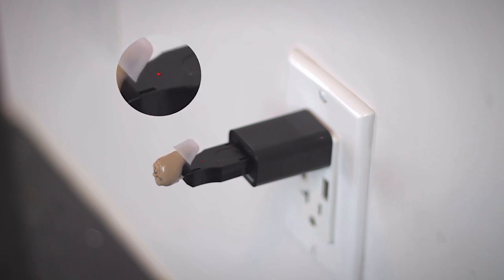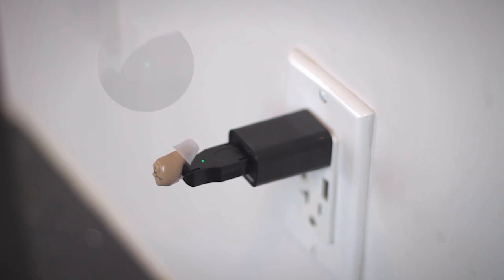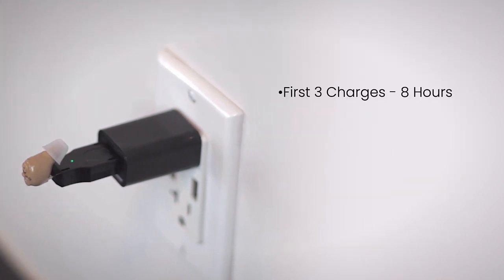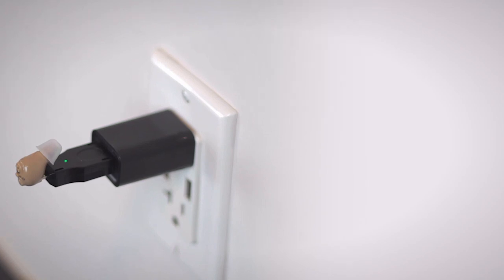Once the device is completed charging, the light will turn green. The first three times you charge your hearing device, it must charge for 8 hours. After that, it will only need 4 to 6 hours to be fully charged. When fully charged, the hearing device should last up to 35 hours. Remember to only use the specified charger and battery exclusively designed for this hearing device.